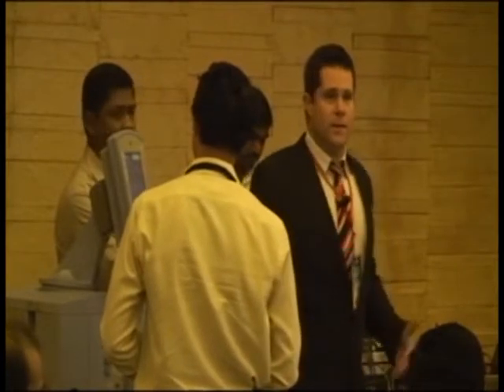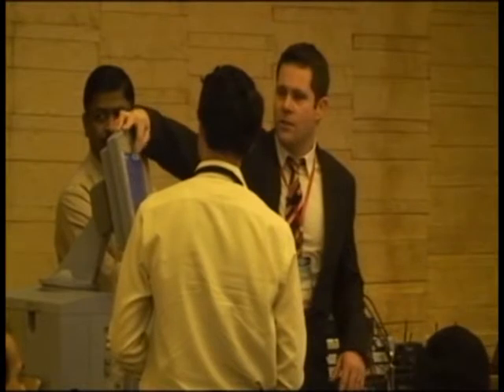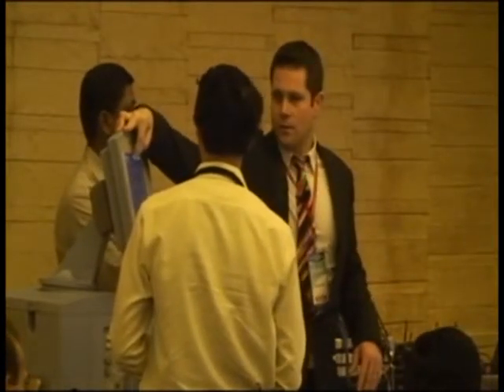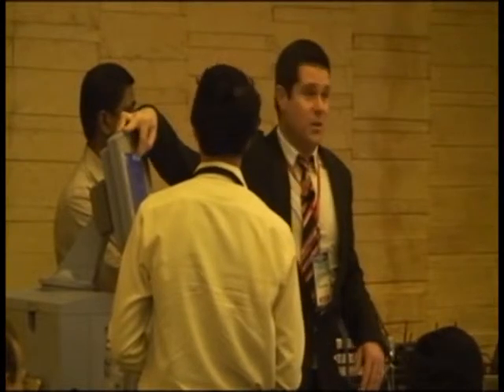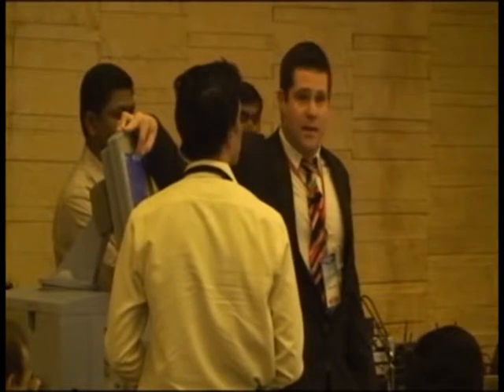Do we know that this patient has auto PEEP? We just assume that this patient has auto PEEP, but the flow's not coming back to zero. Decrease the rate? Okay, but the CO2 is really high. Is that okay? Pay attention. Let's back up for a second. Let's look at our inspiratory pressures. Our inspiratory pressures are super high. Notice they're 70. Those pressures are 70 to move that tidal volume. Is that okay?